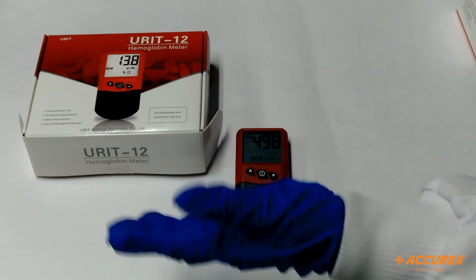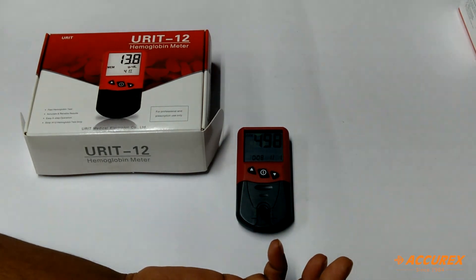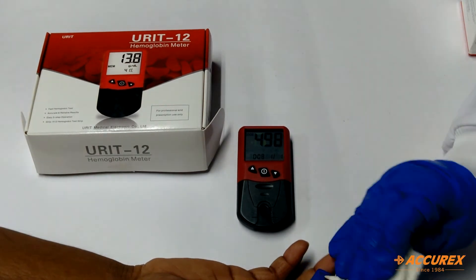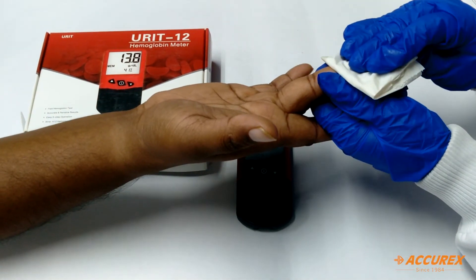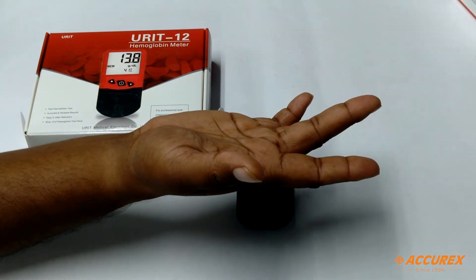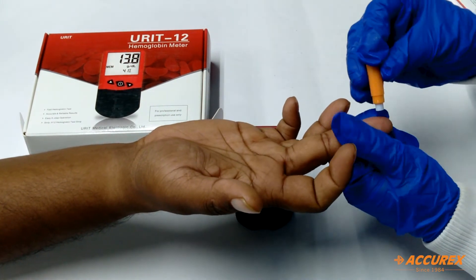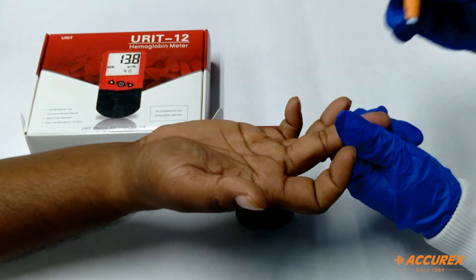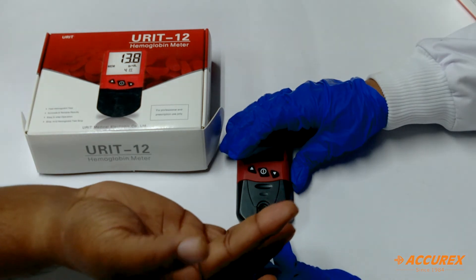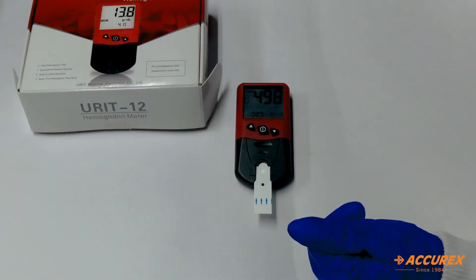First we will take the sample. We will clean the finger, then take the lancet and prick it. We will insert the test strip and place the finger on this point.